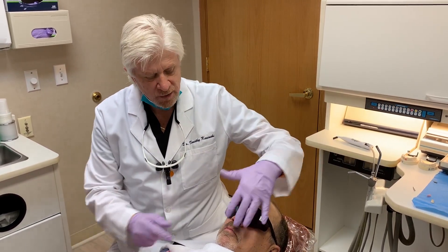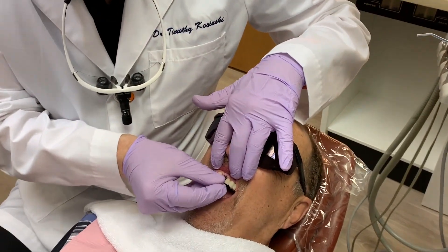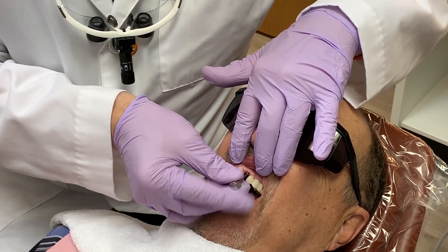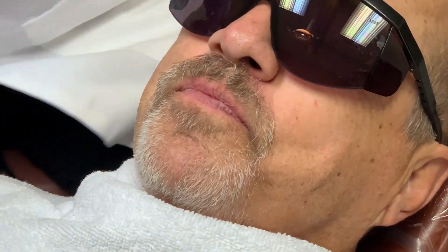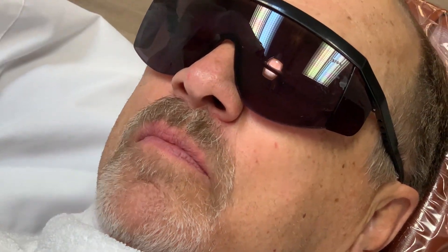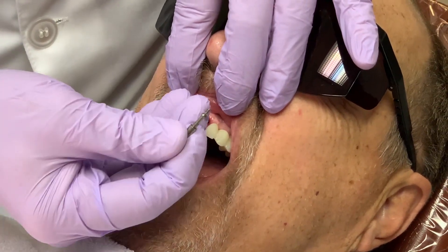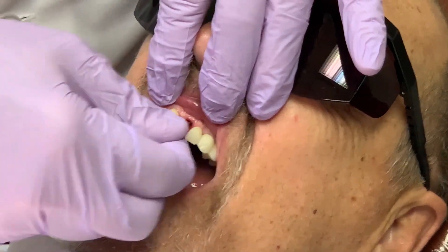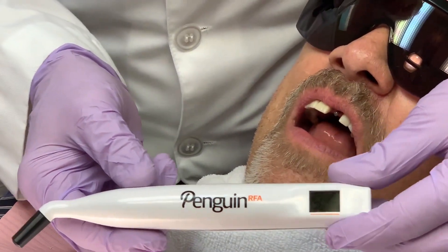We have a patient with a healing implant, and I'm simply going to remove this healing abutment with my tool. The implant has integrated for about four months. I'm then going to take the Penguin multi-peg and thread it into the implant — just hand tighten it. The Penguin unit is self-contained and very easy to transport.